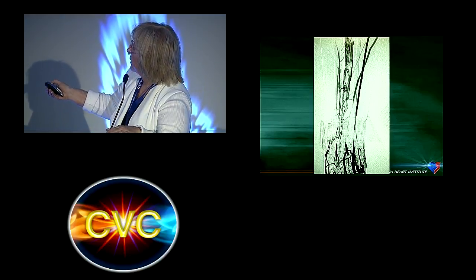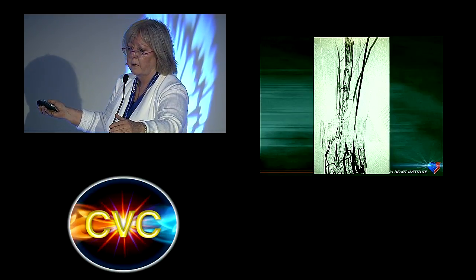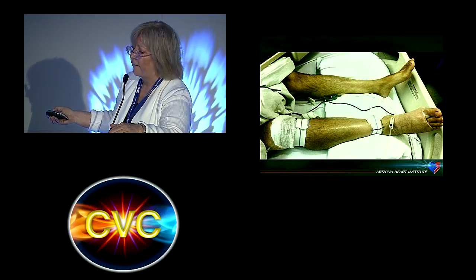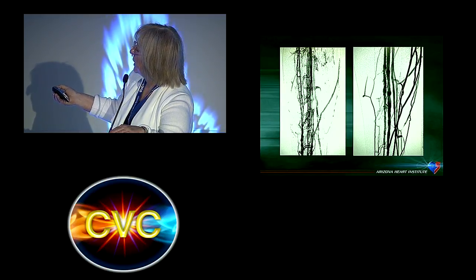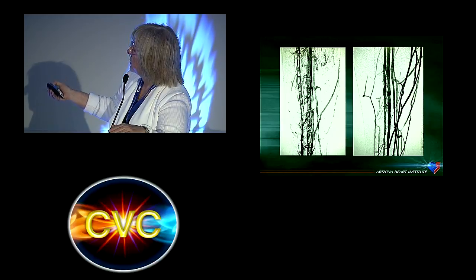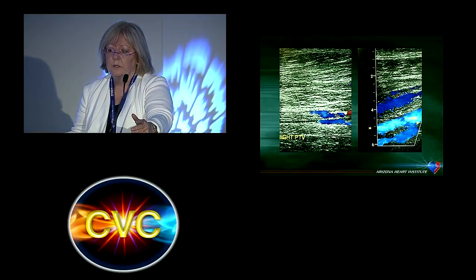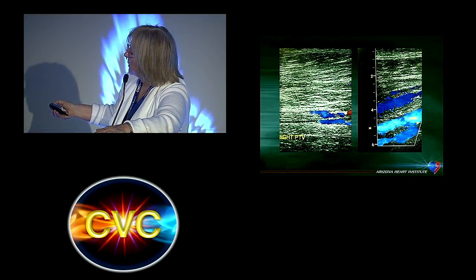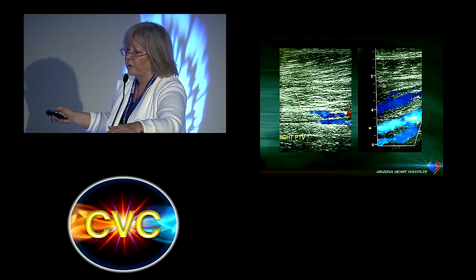So here's an example of a lot of clot in the peroneal veins, just full of thrombus, actually quite dilated. This is the patient with the tourniquets in place, perfusing TPA, and this is the post-venogram, and that's in 48 or we usually go 48 or 72 hours. So you can see you've recaptured this venous conduit, you've lost how swollen it is, you've gotten rid of the clot. It really works, as long as the tourniquets are on tightly enough. If they're not, of course, it's not working. And we can confirm that as well with the increase in the duplex flow. So no flow here, almost no flow here, good flow with good augmentation.